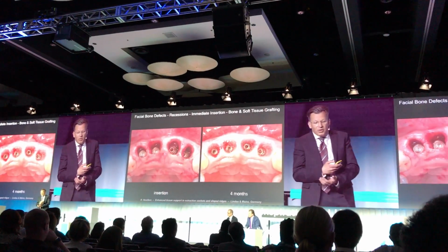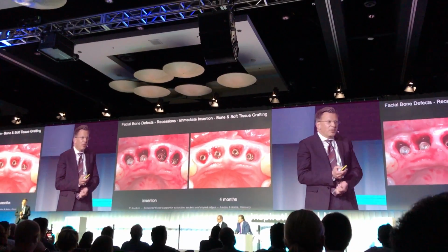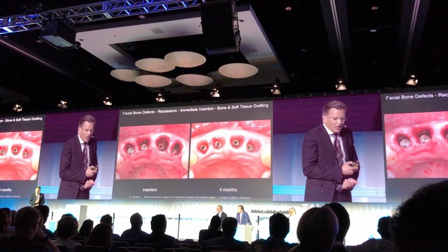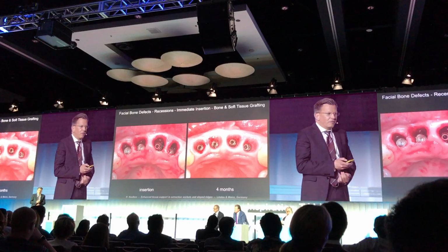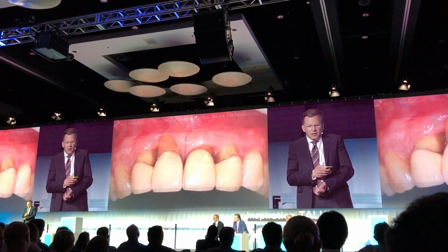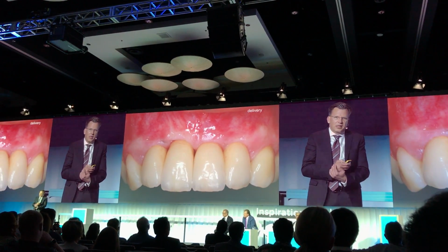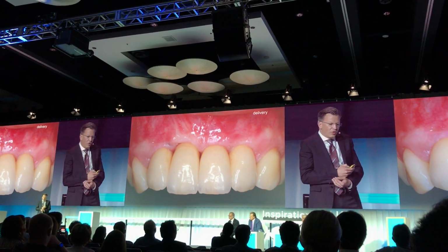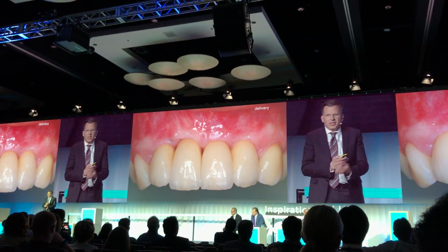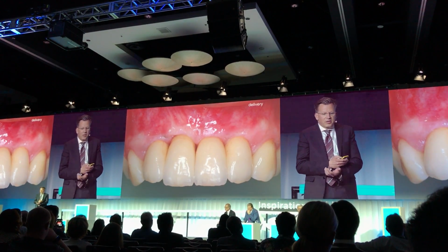So we reconstructed with a lot of autogenous bone chips without cutting any papilla. And from the coronal aspect at 4 months, you can see that we were able to reconstruct, between the central and lateral incisors, the situation where the papilla was lost and the attached mucosa was gone. And you can see the initial situation once again, and now the newly created tissue volume at the delivery of the crowns.